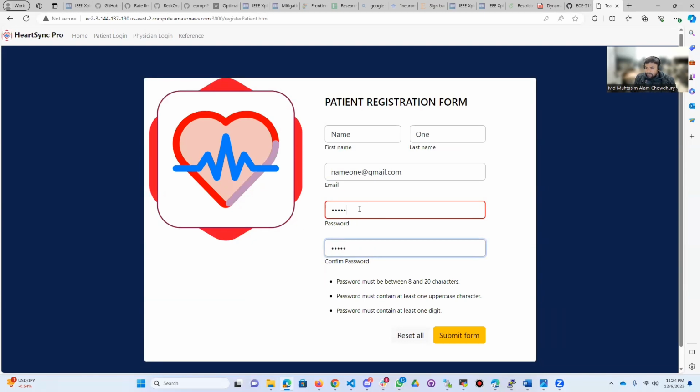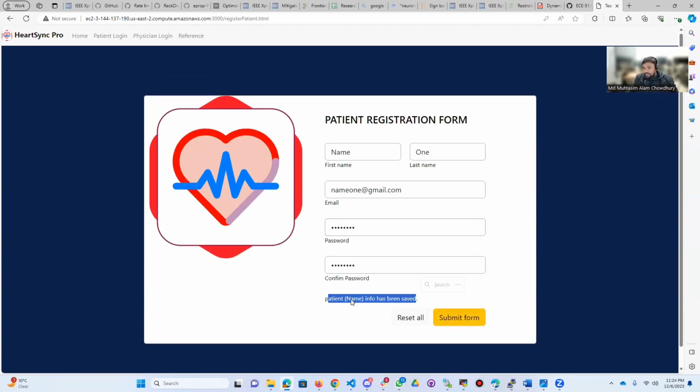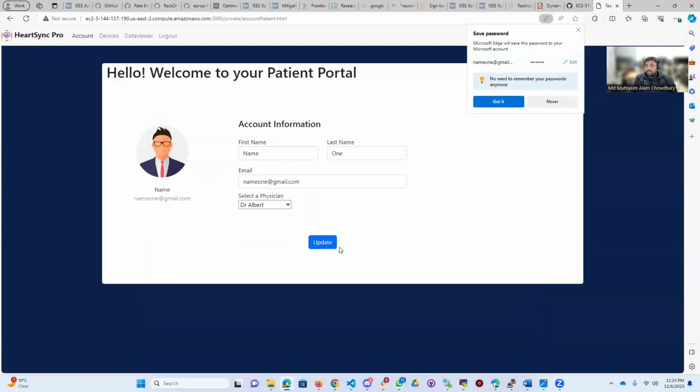I guess it needs 8 to 10 characters. So 1234, submit. Yes, it shows the patient name has been saved. The name is literally the name, so don't be confused. Okay, we can reset it and do the same for another person. Then we can go to the patient login, enter name1@gmail.com and the password, and start logging in.